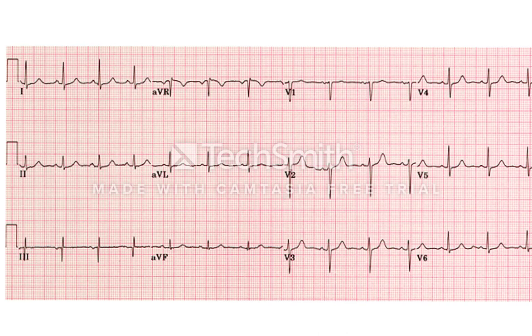So let's review what we know so far. Here is the 12-lead EKG. We know that when we look at this, we're going to look at lead 1 for a P wave, make sure it's upright in lead 1, as well as upright in AVF, and that'll reassure us that this is sinus rhythm. We also can see that the AVR P wave is inverted, and that it's also upright in lead 2. The most important are lead 1 and AVF for evaluating for sinus rhythm.